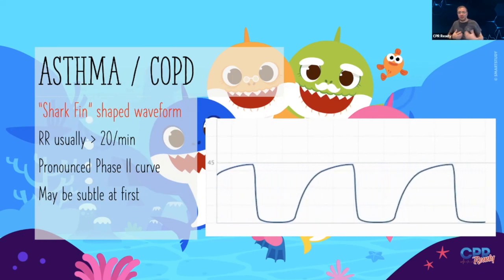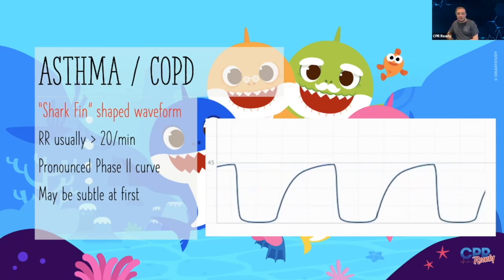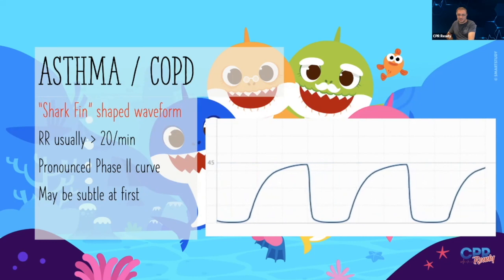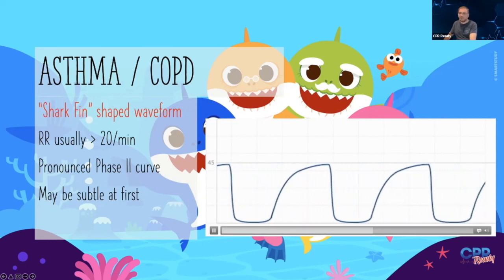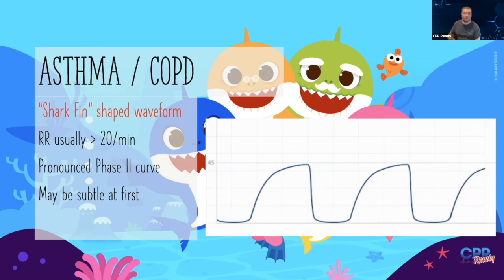So when there's a lower airway obstruction, like bronchospasm from asthma or COPD, then you're classically going to see a capnogram that looks like a shark's fin, just like you're seeing over here. You see how it's got this slurred line at the beginning, and then this point and this abrupt drop looks just like a shark fin. And that is classic for a lower airway obstruction.